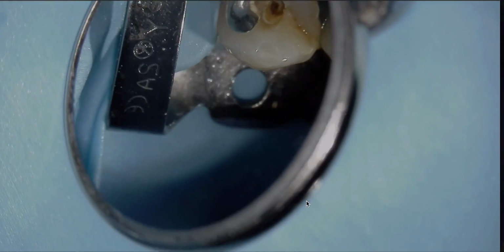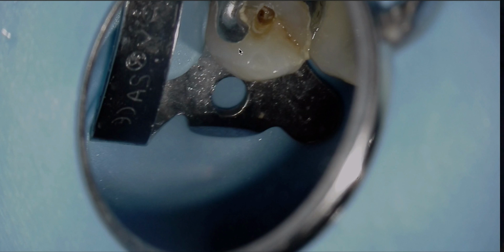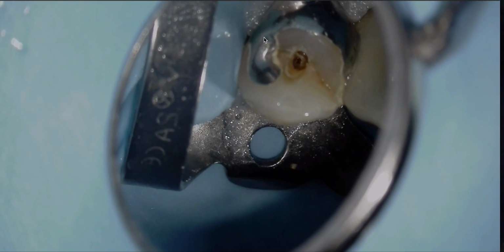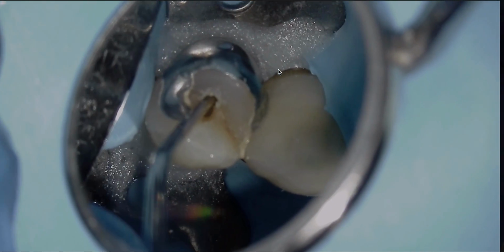So we dropped in, and you can see here, we're a little bit more to the mesial than I'd like, so there you go. But it's probably a pulp chamber that's going to open up, and then you can see the top of the pulp horn here. So this is a necrotic tooth because we're not getting any hemorrhage, or even irreversibly inflamed teeth don't hemorrhage that much, but this one's fairly necrotic, and it confirms our pulpal diagnosis.